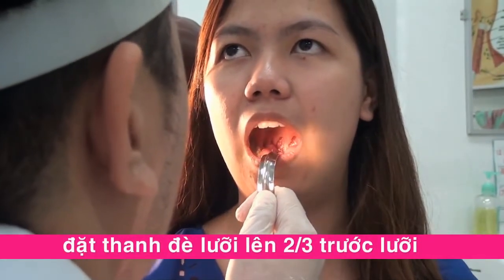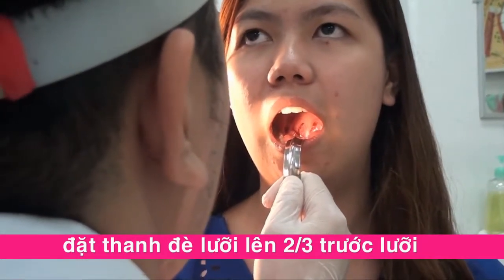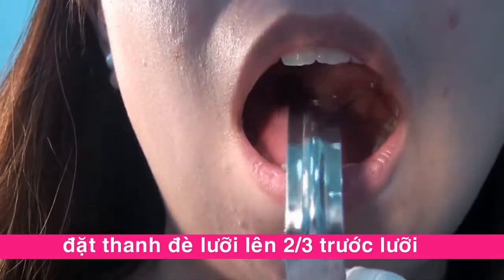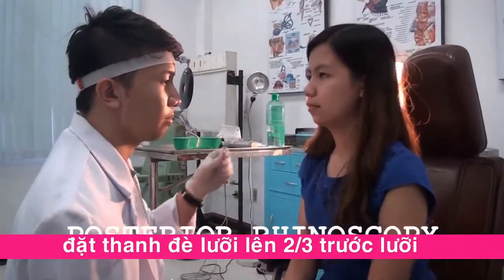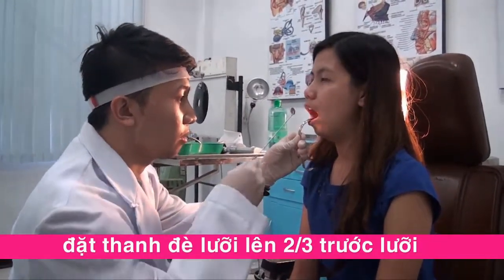The patient maneuvers the tongue to assess its dorsal and lateral aspects, the floor of the mouth, and the tongue's rotation and limitation of movement. If inspection reveals changes, the affected region or structure should be palpated using a gloved finger to assess consistency and depth. Posterior rhinoscopy may be done to assess the nasopharynx and posterior nasal cavity.